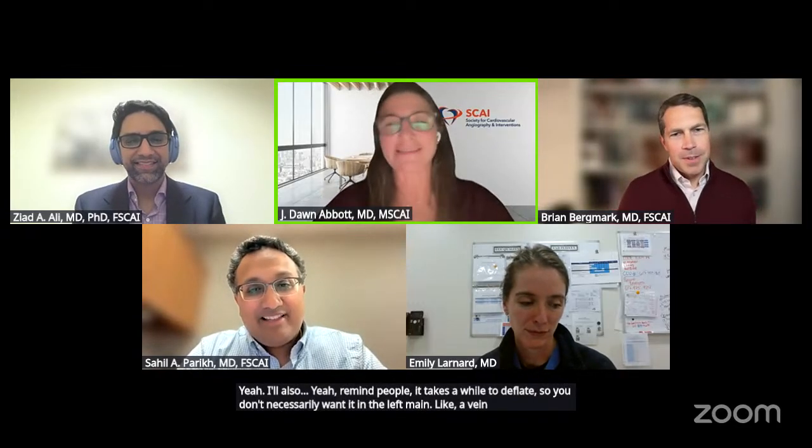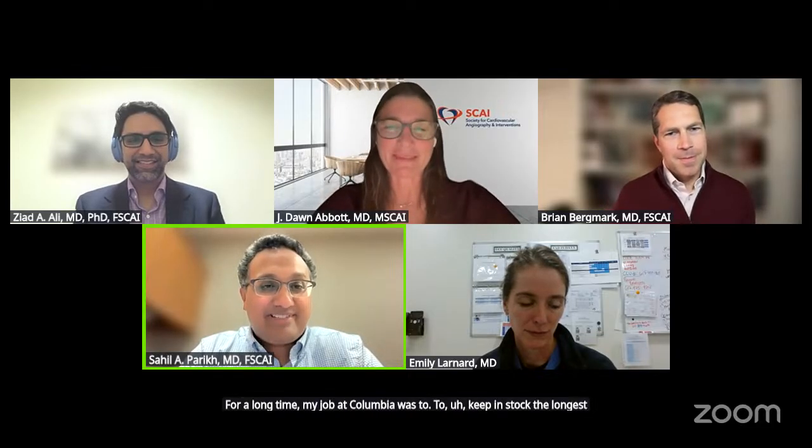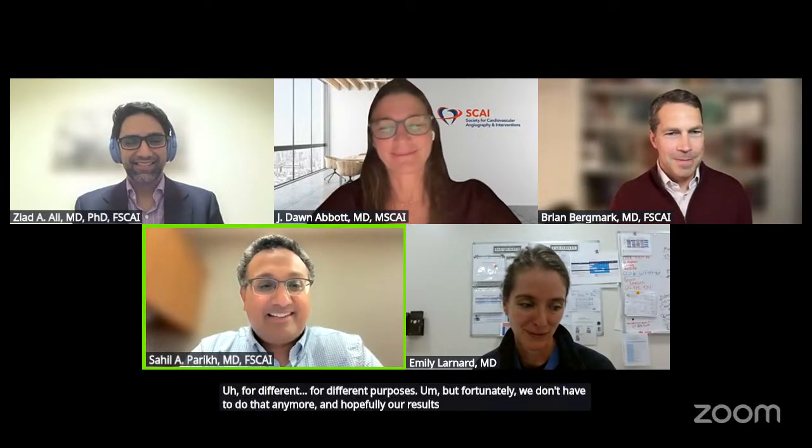Yeah, for sure. I'll also remind people it takes a while to deflate, so you don't necessarily want it in the left main. Like a vein graft, maybe, a RCA, maybe. But for a long time, my job at Columbia was to keep in stock the longest and shortest DCBs available on the market for different purposes. But fortunately, we don't have to do that anymore, and hopefully, our results will be more like that which we saw in the Asian trial than in some of our other ad hoc experiments.